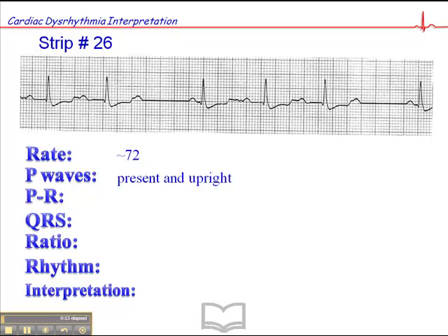There are P-waves present and upright, and they seem to be consistent in morphology. The PR interval — this is the hallmark, the key here in this rhythm — the PR interval appears to be increasing in length. If we look at the PR interval here, it's not quite as long as this one here, and then we have this P-wave that stands alone, and then we have this short PR interval, and then the cycle begins again: prolonged PR interval, even longer still, and then this P-wave that stands alone, and then a short PR interval again.